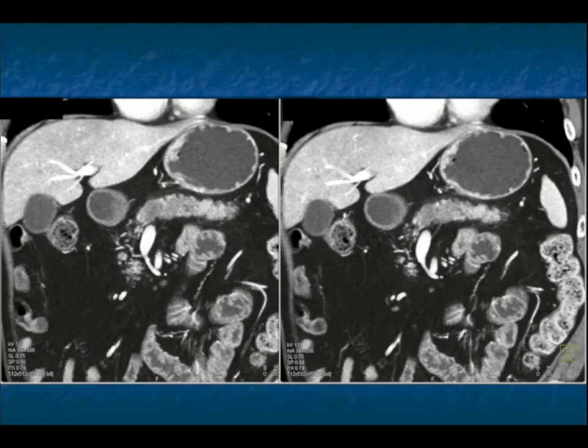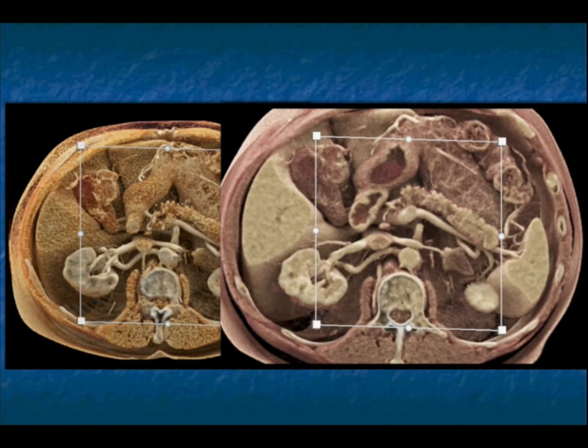Here it is on the coronal oblique views, really nicely showing you the low density, classic for adenocarcinoma, minimal glandular stranding. Sometimes you get a combination of the mass, obstruction, and mild pancreatitis. And you see the dilated pancreatic duct with cinematic rendering very similarly.